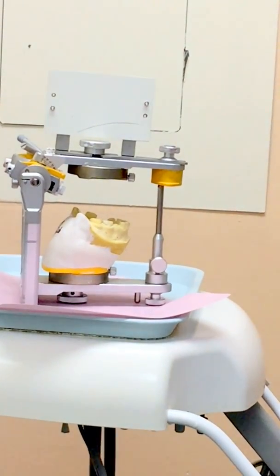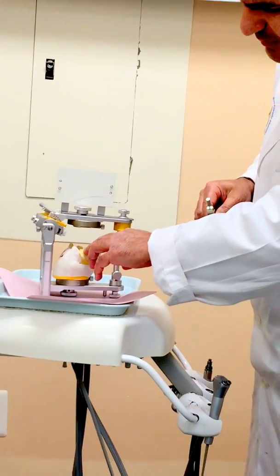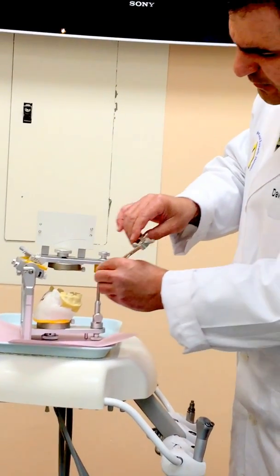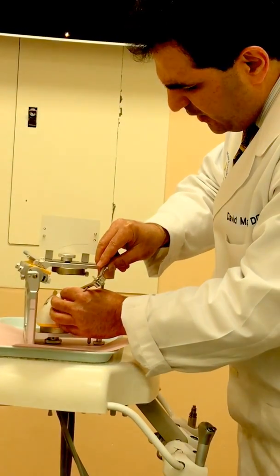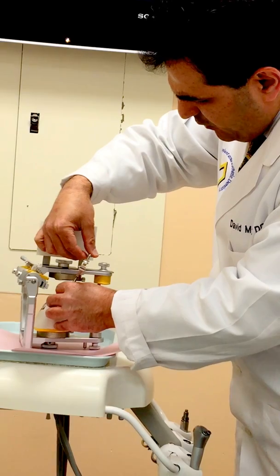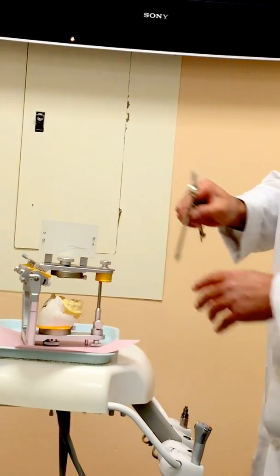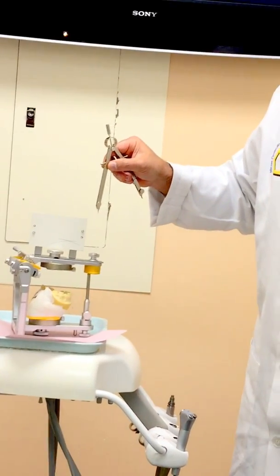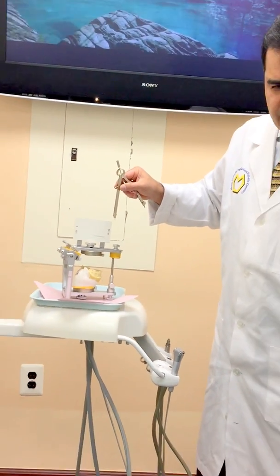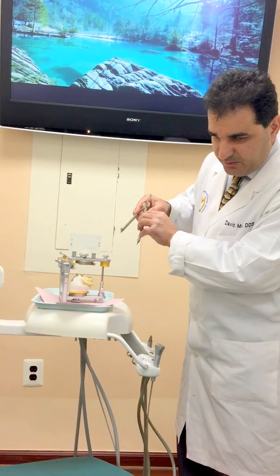My PSP, or posterior survey point, is going to be the distal buccal cusp of the second mandibular molar. I secure that, and these two arcs are going to be coinciding in one point. That point and that spot is going to be the center of the curve of Spee, or the center for the compensating curve.